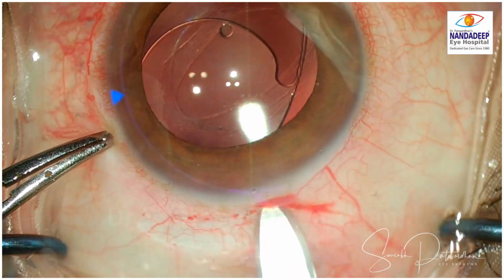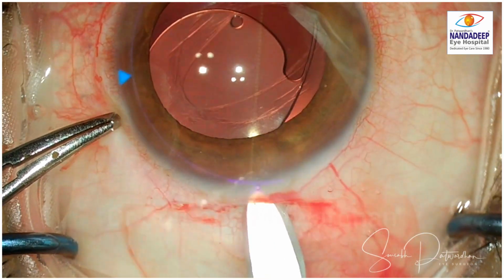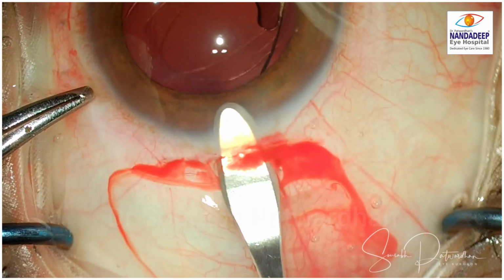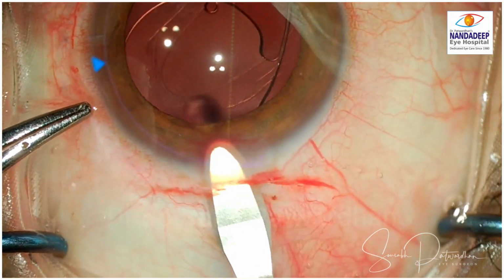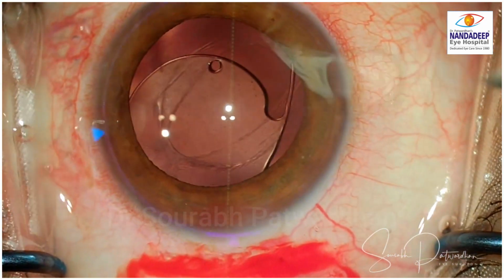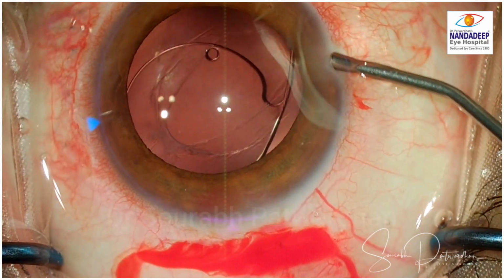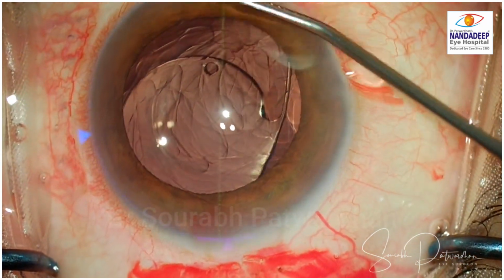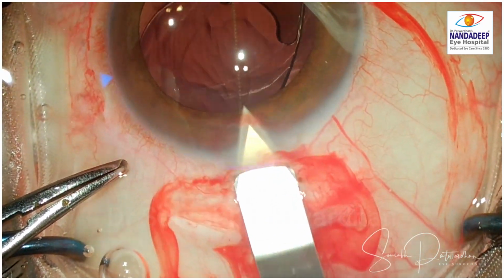Now here, to take care of the against the rule astigmatism, which is because of the superior tunnel which was probably done by the surgeon to remove the nucleus once the rent was noted, that has caused against the rule astigmatism, and that's why I am going to take a temporal scleral incision. Now the side port is made and the anterior chamber is filled with OVD 2% HPMC. Now entry is made from this temporal incision.